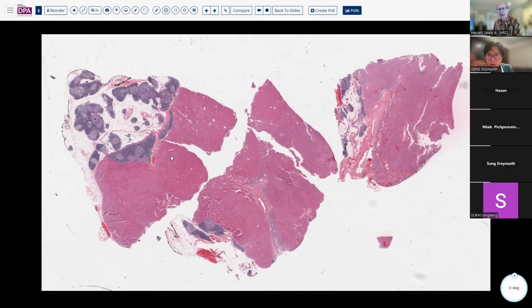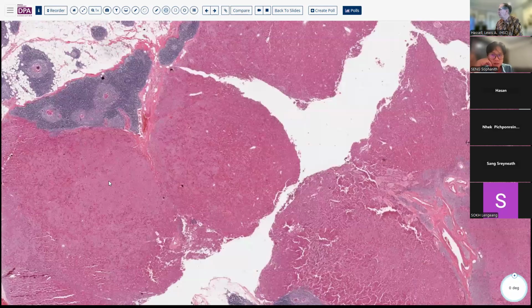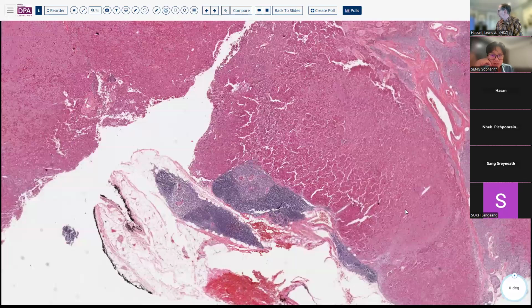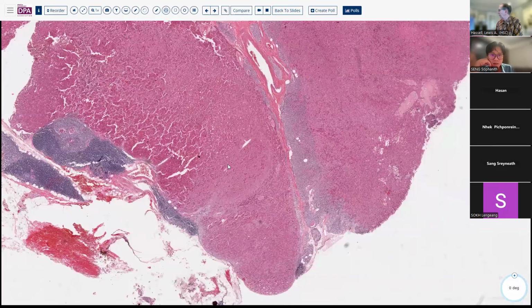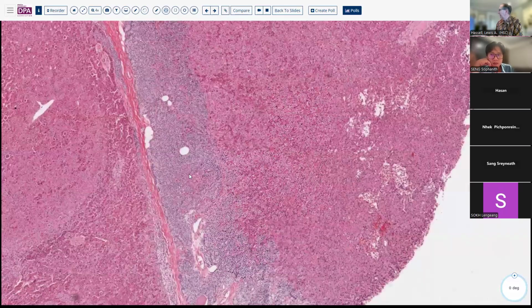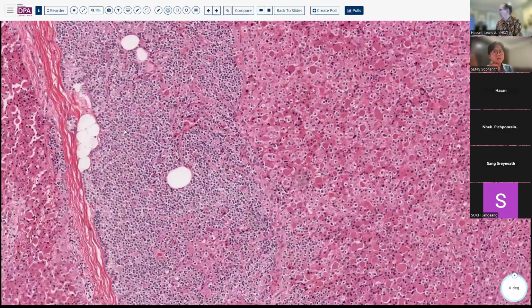Okay, so one of the unexpected findings in the thymus sometimes are other branchial cleft vestigial lesions. I mentioned those ductal elements we just saw. But another possibility is that you actually have ectopic thyroid or ectopic parathyroid tissue. And actually, in this case, there's a little clue over here. You see this eosinophilic tumor, very rich here, adjacent to the thymus.